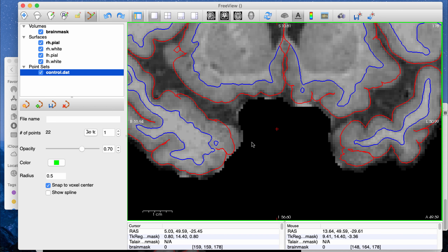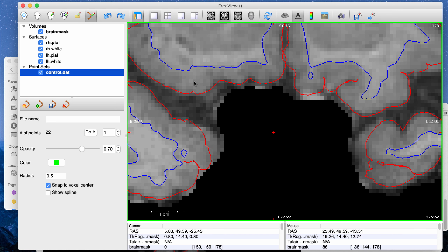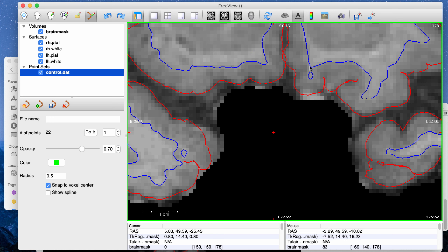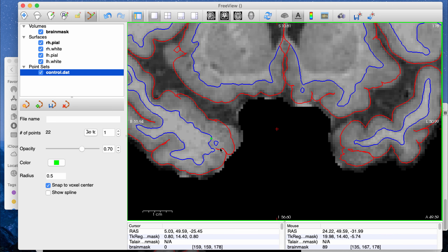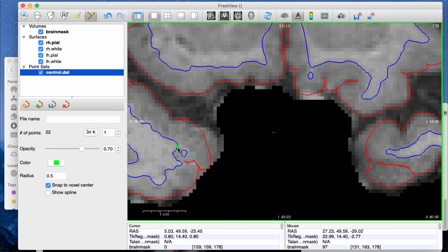An important thing to keep in mind when doing these edits: since what you're doing is intensity normalization, what you're really saying is that the color of that voxel should be considered white matter. FreeSurfer is going to check all voxels with that same intensity and change that intensity to white matter. So you can make an edit in one location, but because it checks intensity throughout the brain, it can actually affect other areas. Make sure that when you're clicking, you want that intensity of the voxel to be labeled as white matter.